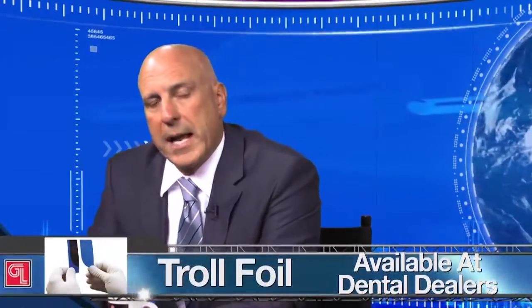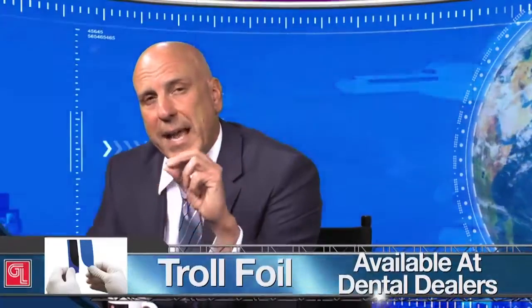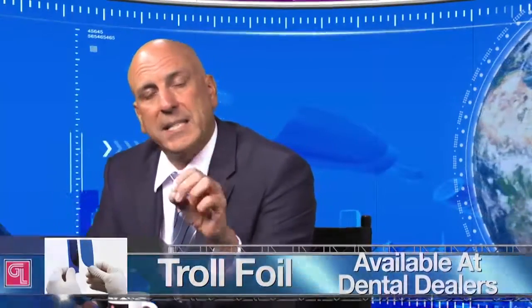or in this case, articulating paper. So when you look at different articulating papers, AccuFilm, for instance, has a thickness of about 20 microns, and so it's pretty thin. And so sometimes pinpoint contacts don't necessarily show up with something like AccuFilm 2. My favorite that I use is actually called Troll Foil, and I like Troll Foil a lot, but that's actually even thinner. That's only 8 microns thin, and so you get some nice distinct marks, but there are definitely times where it won't mark, and when it doesn't, I step back what I consider to be a generation, and I go back to the Madame Butterfly Silk from Almore, A-L-M-O-R-E, and that's 90 microns thick.